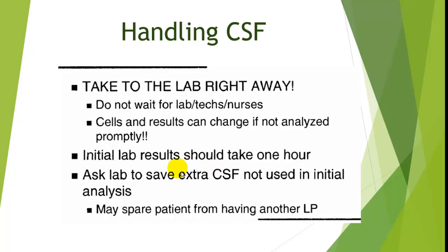It's a good idea to get the spinal fluid to the lab as soon as possible, because otherwise there could be lysis of cells and an inaccurate counting, or the glucose levels could go down. Any number of changes can take place if there's an excessive amount of time from the time that the fluid is collected to when the lab begins analysis. And so if you can take it down yourself, the patient would benefit.